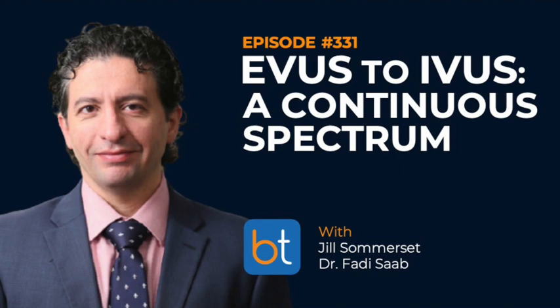I see. Yeah. And then, Jill, you alluded to some situations where EVUS might not be helpful, like if there's a big rock hard plaque. Any other scenarios that you commonly see where EVUS isn't going to be helpful in a case?